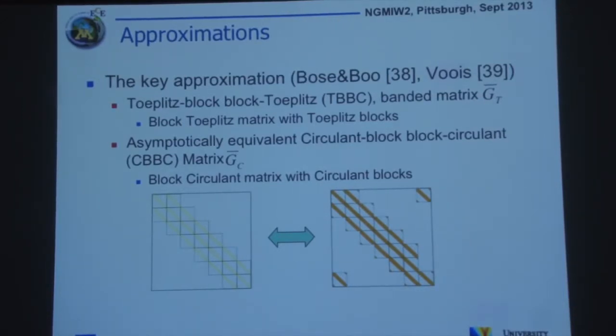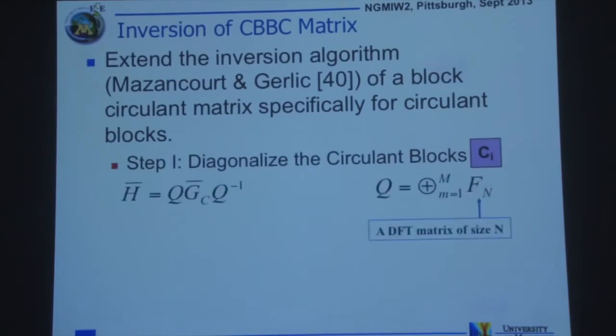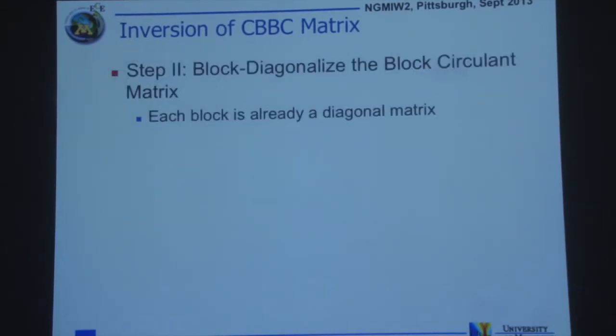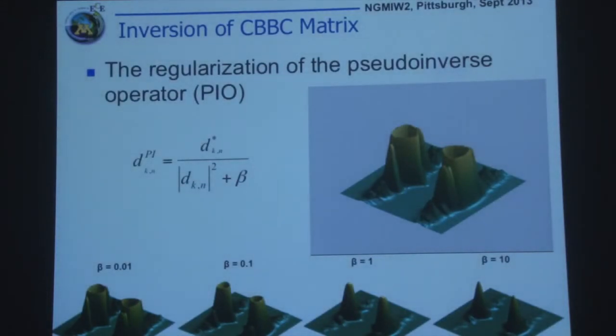And I should mention, with the circulant, you can see what that means: there is a DFT coming, but not only a 1D DFT like we did in the past, but actually a two-dimensional DFT. It accounts for both the axial and the lateral impulse responses of the array in terms of the side lobes. And this circulant formulation allowed us to solve the problem using a two-dimensional DFT approach, which is diagonalized. So I'd like just to show how this works.